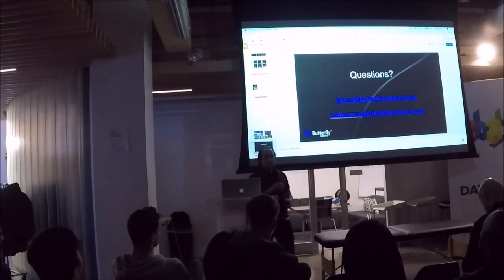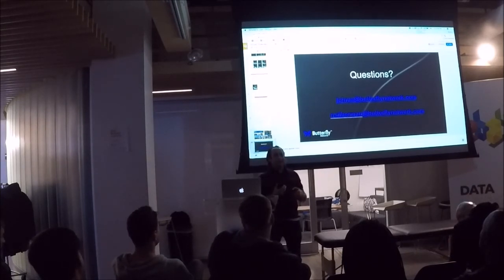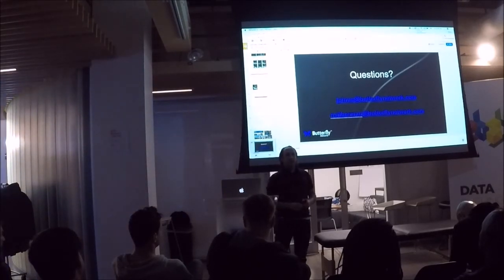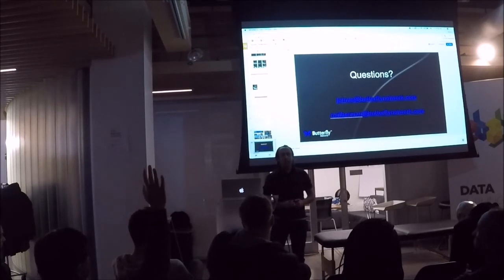Totally. So our constraint there is we really want to add as little as possible. We really want to have just the probe, just the phone. That's really it. So it certainly can be solved in a bunch of other ways, but we really wanted to make it as liberated as possible from additional constraints.